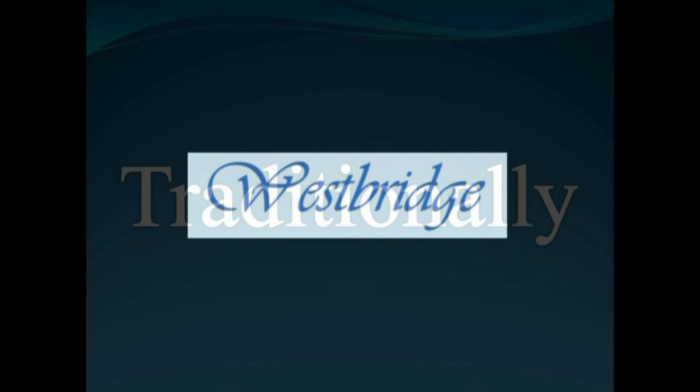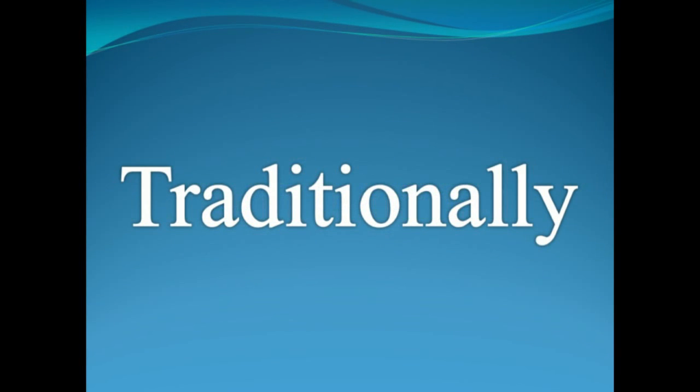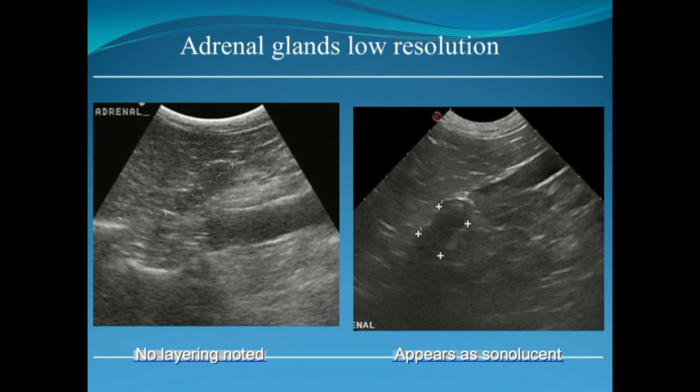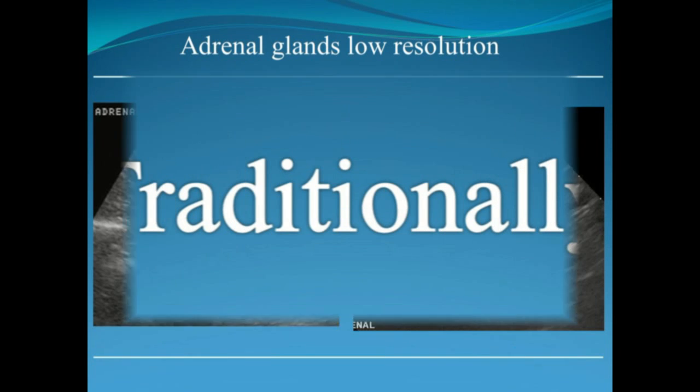When it comes to how we've looked at things in the past, the tradition has been to measure the caudal pole of the adrenal gland and with it make an assumption whether the animal is cushingoid or not. Many of the observations that we've made on adrenal glands is they are plump or anechoic, and in my personal opinion, I really wonder if they add anything to our diagnosis. I mean, the truth being said, what does it really mean?